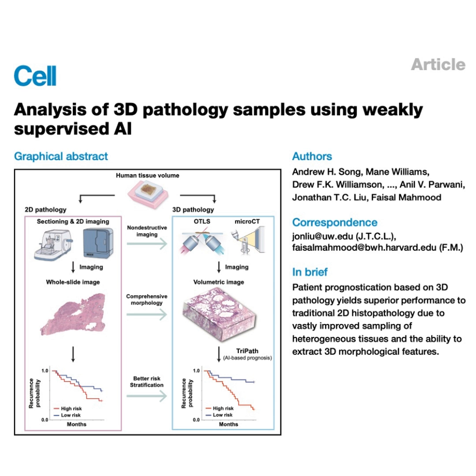It does, and it does it through a smart pipeline. There are basically 3 main steps. First, tessellation. Tessellation, like tiling. Exactly like tiling. It takes the huge gigavoxel input volume and sort of mathematically chops it up into thousands and thousands of smaller, manageable 3D cubes or patches. They call these instances. Okay, so break the big problem into lots of small pieces. Makes sense.